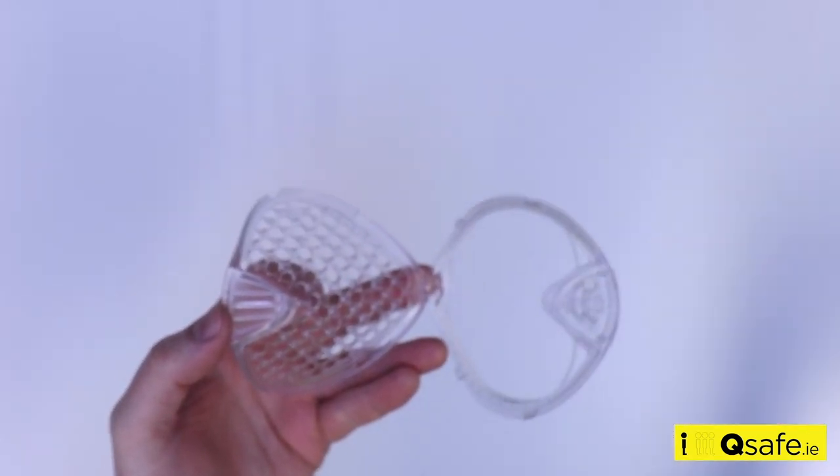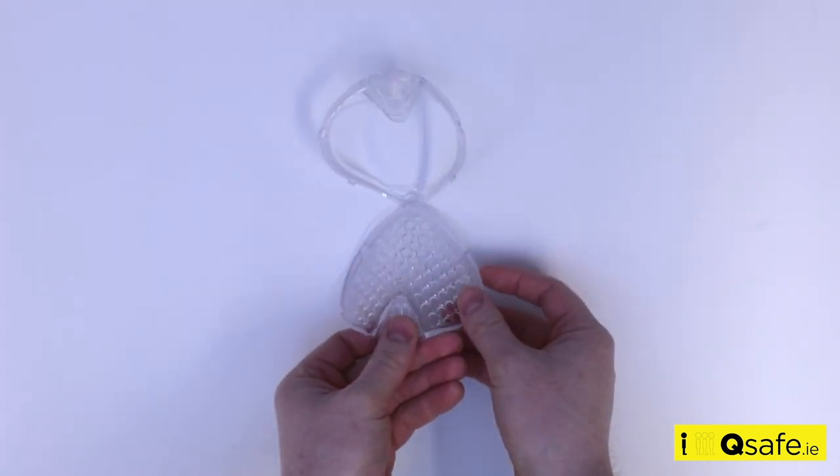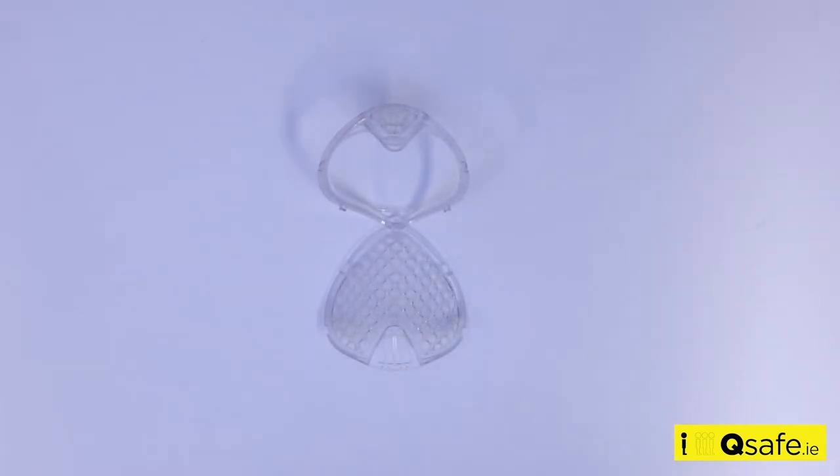After disposing of the filter, be sure to wash your hands according to recommended guidelines before proceeding.